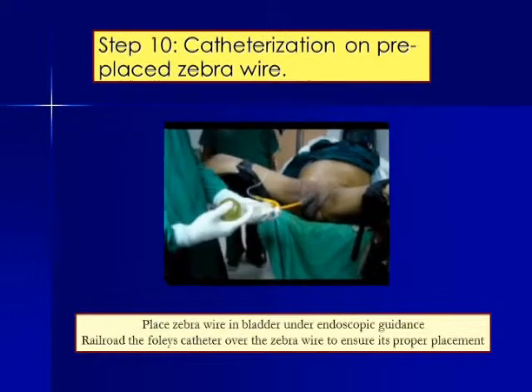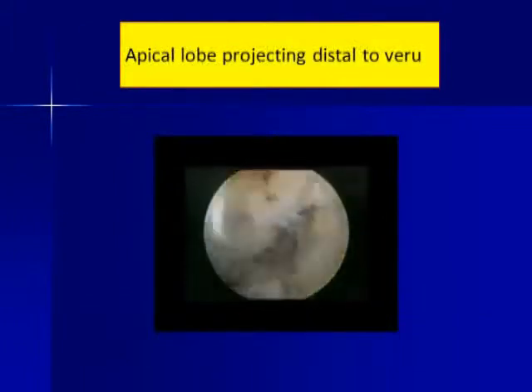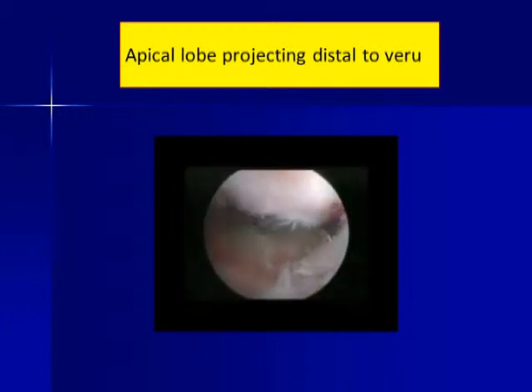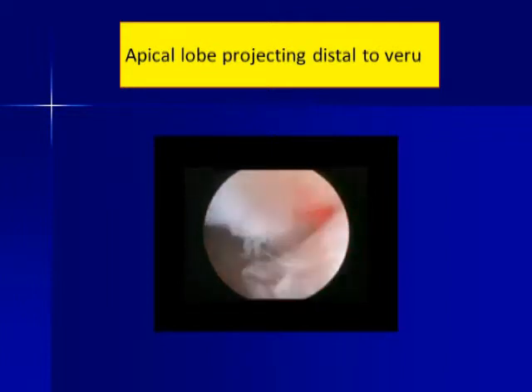Normally I put a zebra wire and put a catheter on the same. Although irrigation and traction is not required, I usually give a mild traction and a slow irrigation as a safety, because we don't really remain with the patient all around, and after we leave the patient we don't want any problems. So as an added safety usually I do it, but it is not really recommended in all the patients. This is another video showing the extent of apical tissues and the sphincter relationship that we can remove, and this can be as far distal below.